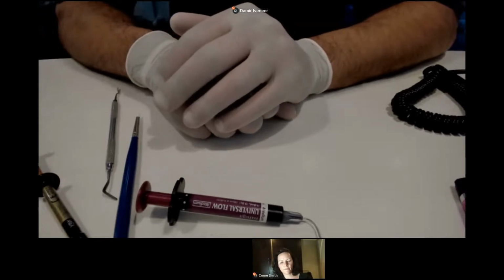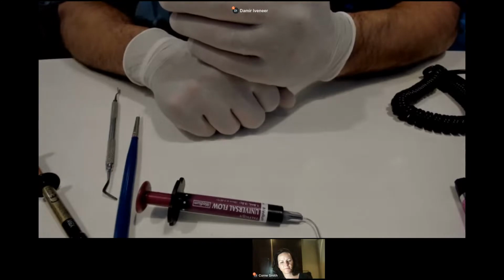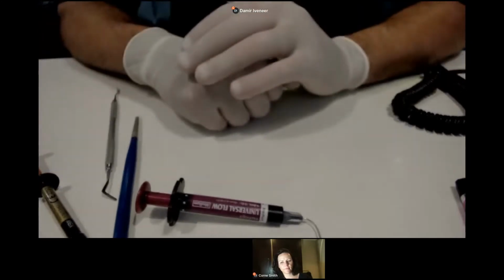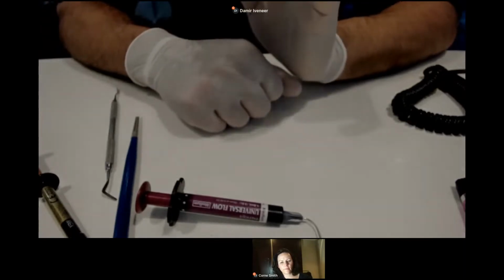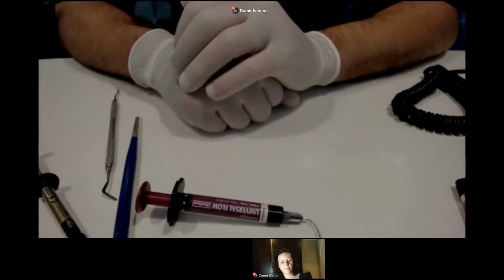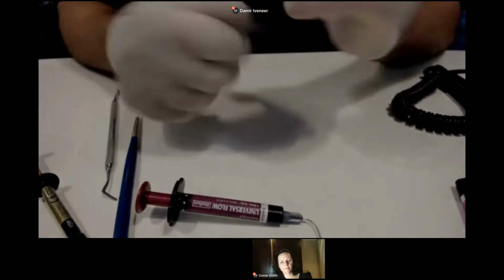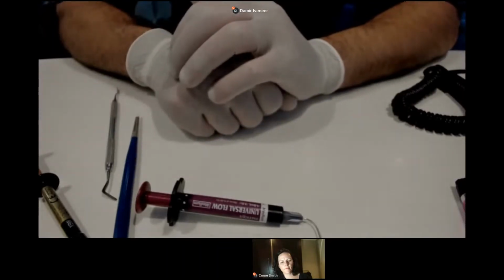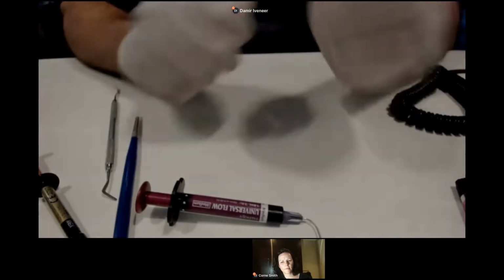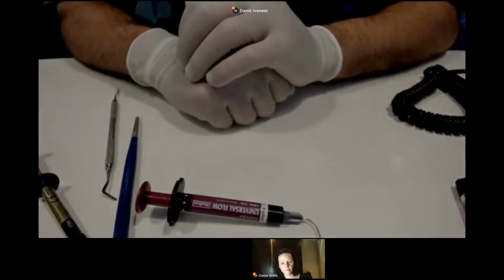But if, for example, I do multiple diastemas and I finish the process, usually I do interproximal finishing with very light discs, not abrasive, okay? And then with finishing strips, and then I can put the other layer and do it with the metal sectional matrix. And again, finish it, check for the contact, and then do another finishing strips.